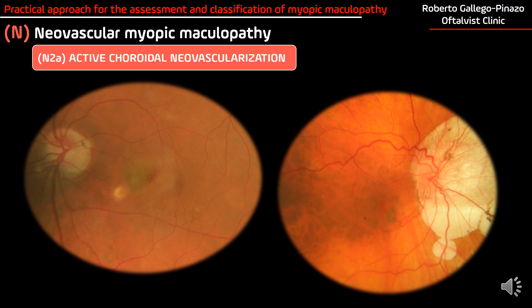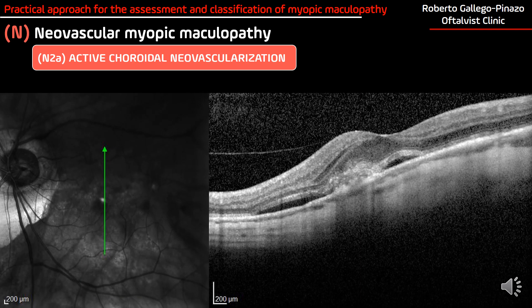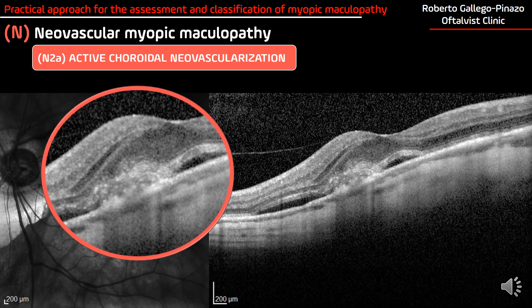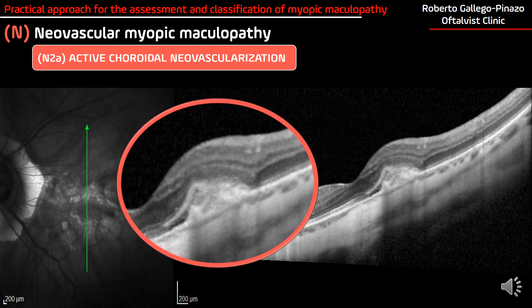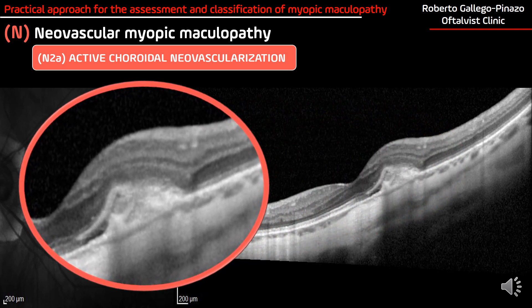Stage N2A is for active choroidal neovascularization, which can be easily identified in the fundus examination, but OCT plays a key role in the detection of such lesions. Myopic patients develop type 2 neovascular lesions, which grow on top of the RPE — which is eroded — and through that erosion the fibrovascular lesion grows within the subretinal space. Here we can see the disruption of the RPE and the fibrovascular lesion causing leakage in the parafovea.